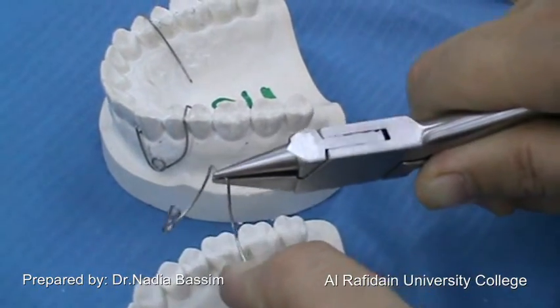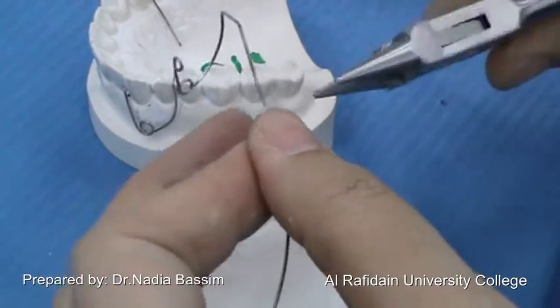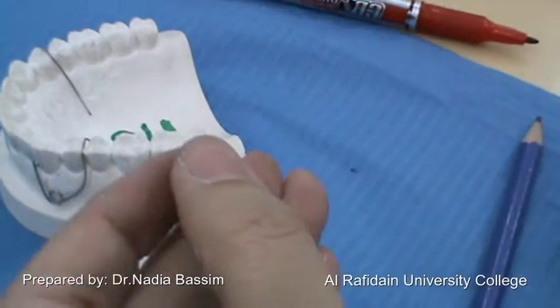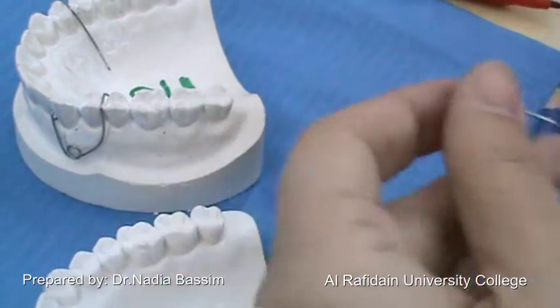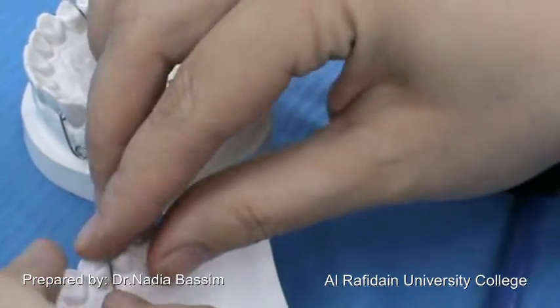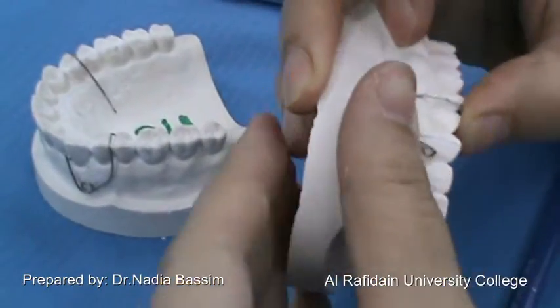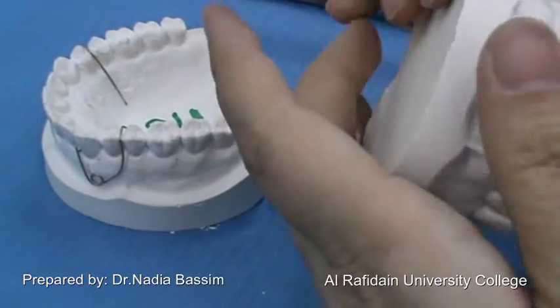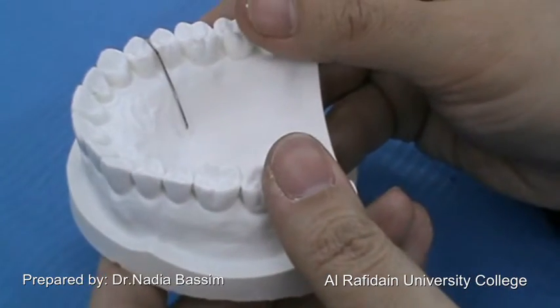Then this is the tag, which is well adapted on the palate. It ends with an L-shape that is perpendicular to the palate. This is the small L-shape. And this is the completed simple buccal canine retractor.